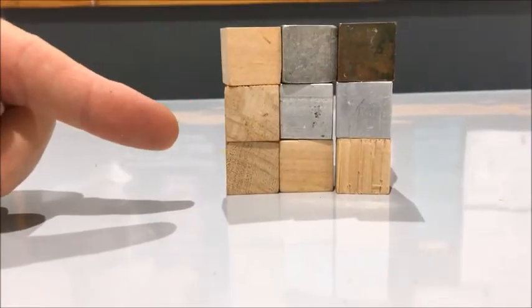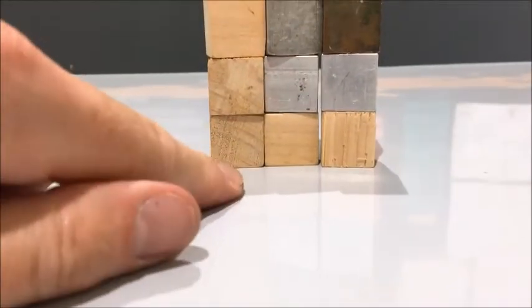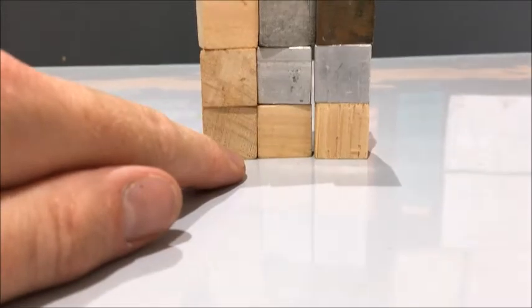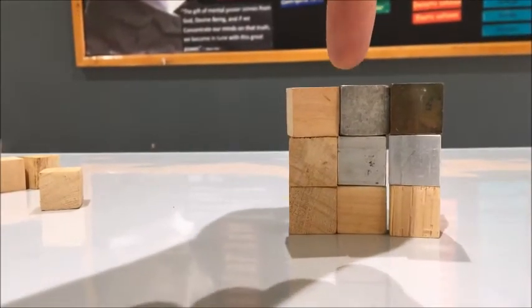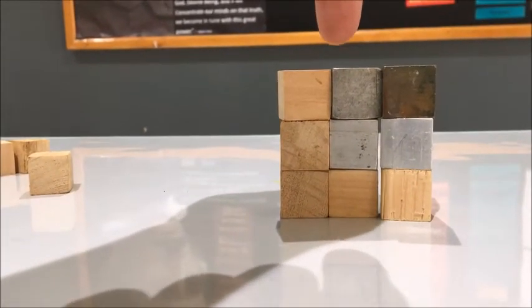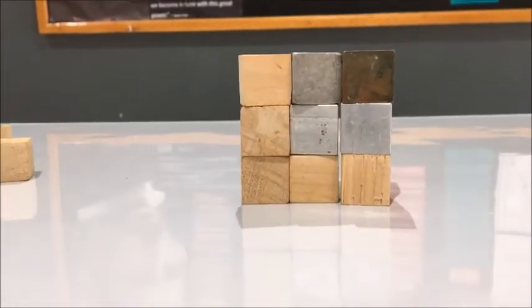I don't need to do it again. And equally, I don't need to do it from underneath either, because I've already got that direction from the other way. So if I've gone that way, I don't need to come from underneath, because the reading will be the same. It's passing through the same stuff.